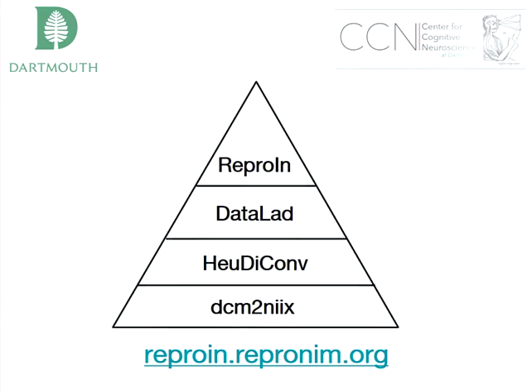And I just want to stress here that we didn't want to reinvent the wheel. And I think this project is an example of why open source science and open science is great. Because instead of reinventing the wheel, we just used whatever open toolboxes already existed, and we contributed to them. For example, we started with dcm2niix to convert DICOMs into NIfTI, and then we worked on HeuDiConv to have a more general conversion from DICOMs into NIfTI. And again, we use DataLad to store everything into Git.